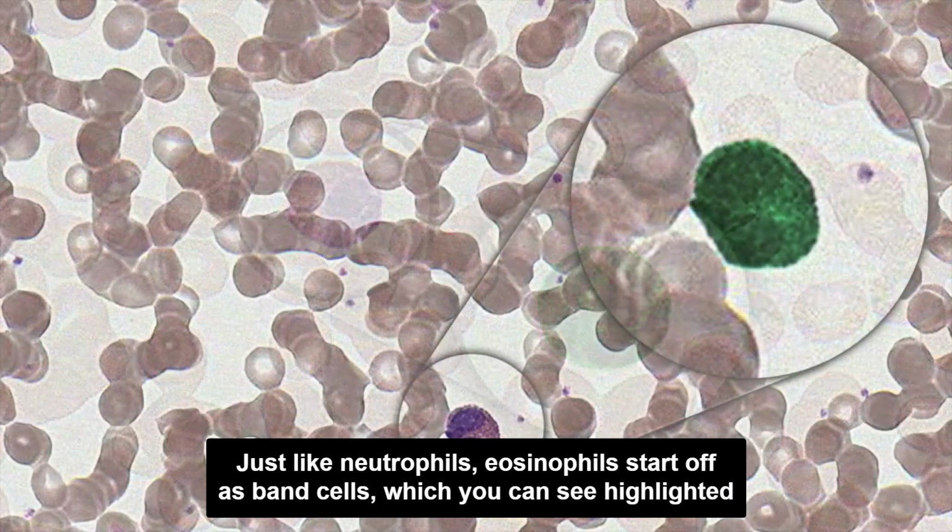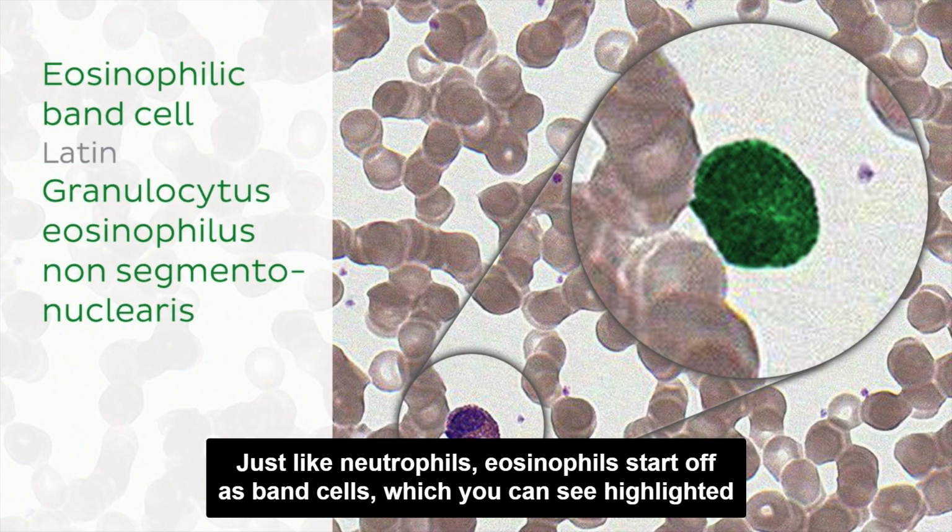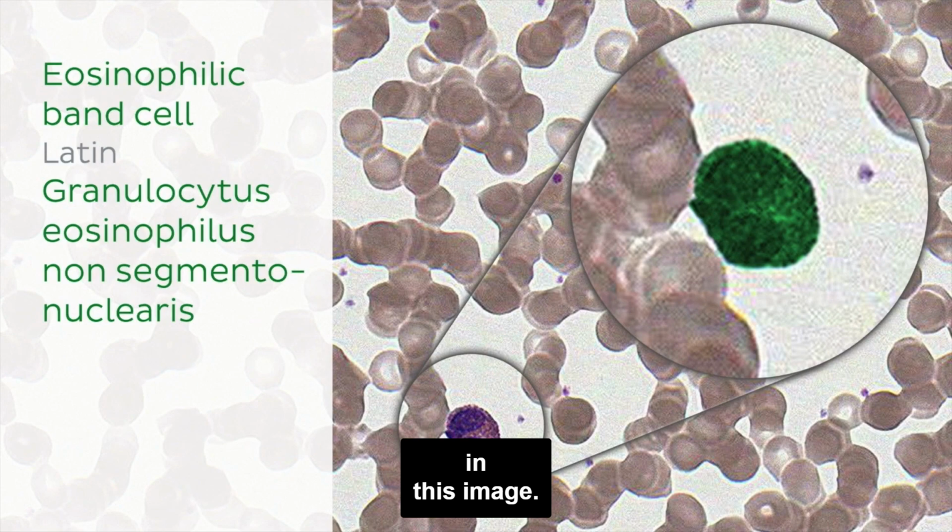Just like neutrophils, eosinophils start off as band cells, which you can see highlighted in this image. Their cytoplasm stains basophilic, as you can see in this micrograph, and contains smaller eosinophilic granules called lysosomes.